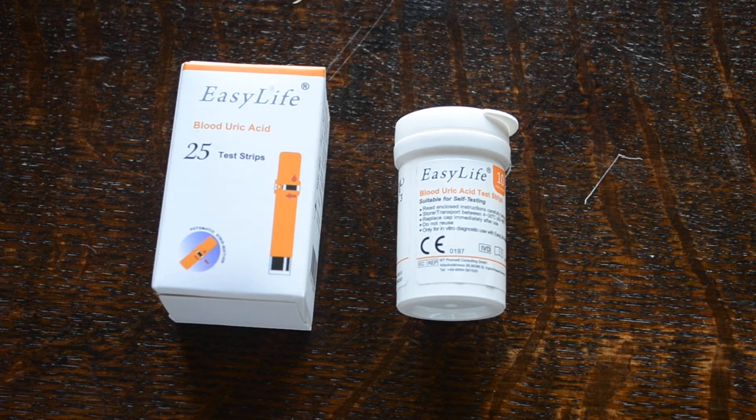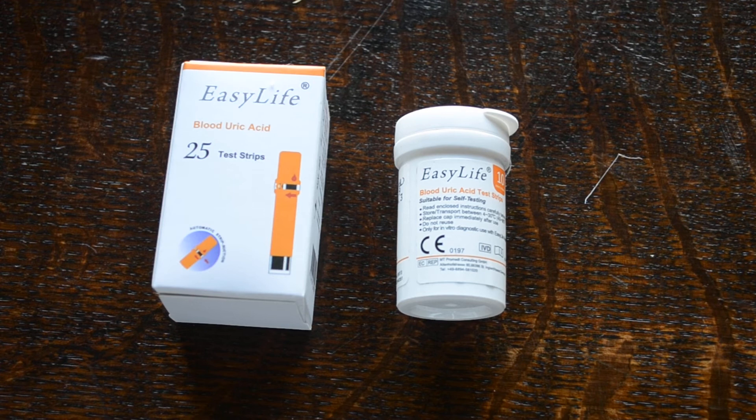These are the 25 test refill packs of uric acid, which is a chemical that is elevated in people that have gout. It's useful to know their levels, so these test strips give them the ability to monitor that on a close basis.